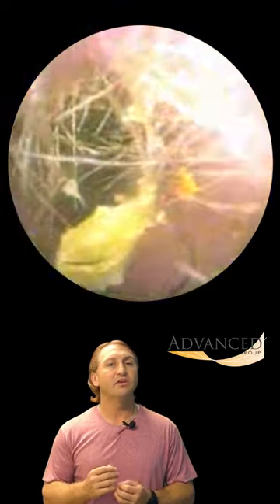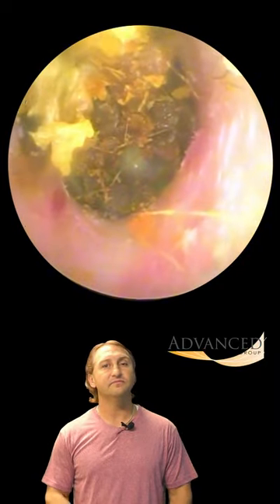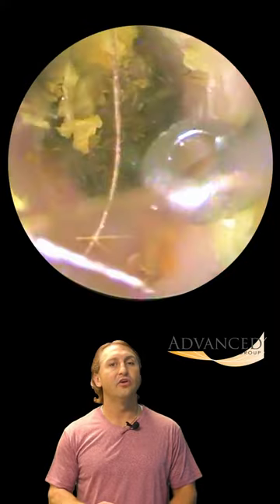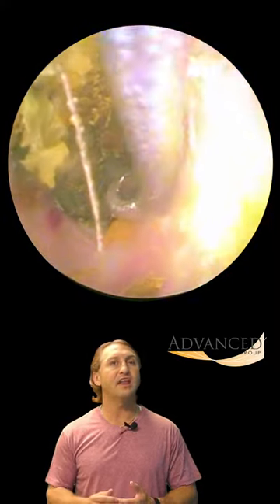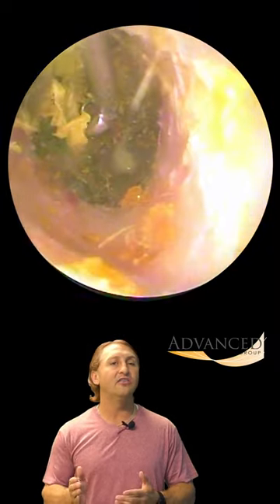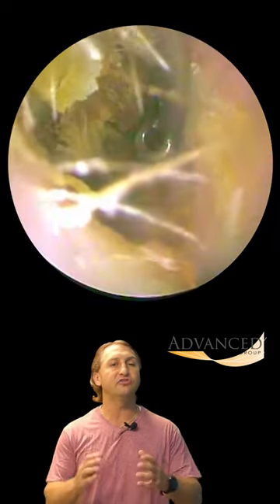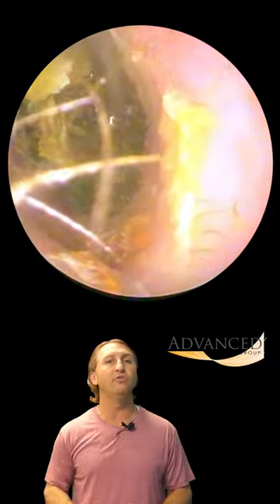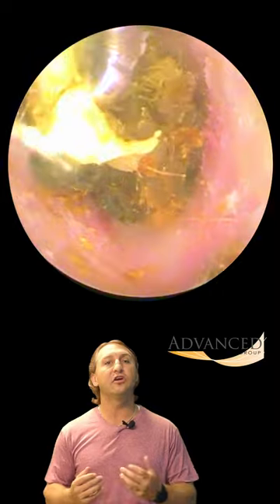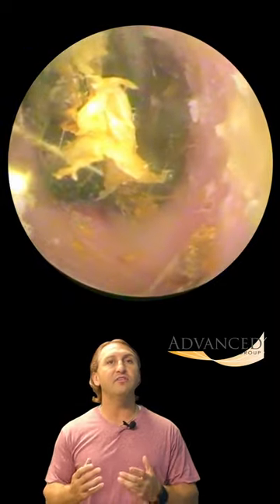Here we go. You'll see it's just going to be a little bit more angled. There it is. And you can see how we're coming in — we're trying to use that angle to get into the opening that the earwax has and get a little bit behind it and use it to pull everything out. You can see it just release and kind of all move at once. The goal is that we're going to get this all to come out, keeping it in as large of a chunk as possible. These movements are actually very, very small.